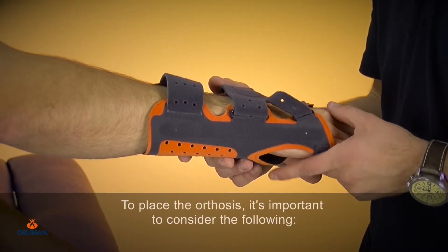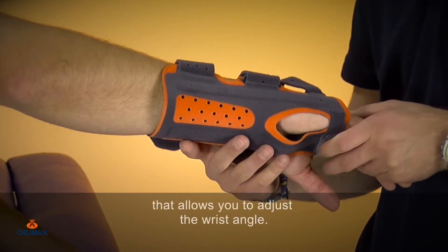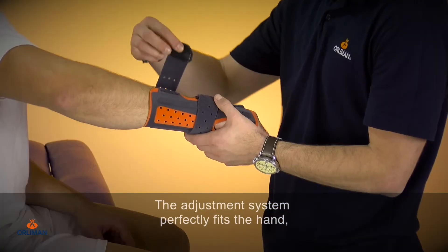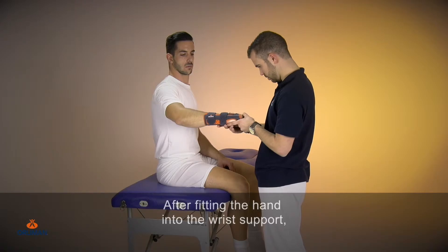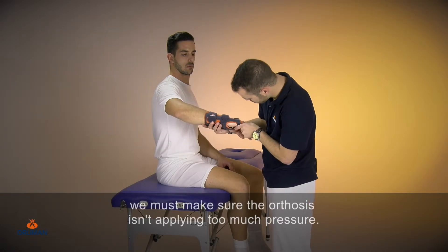To place the orthosis, it's important to consider the following. It features a malleable stiff splint that allows you to adjust the wrist angle. The adjustment system perfectly fits the hand, wrist and forearm. After fitting the hand into the wrist support and setting all the straps, we must make sure the orthosis isn't applying too much pressure.